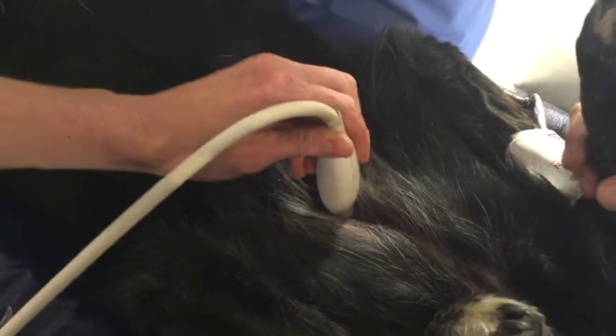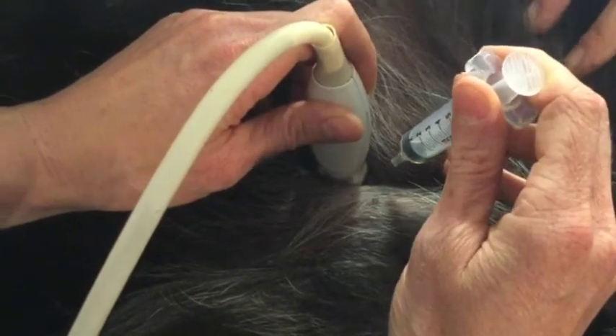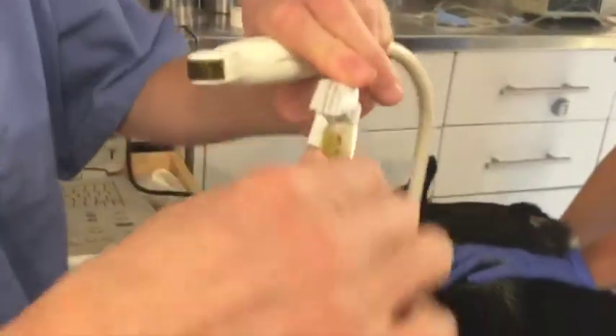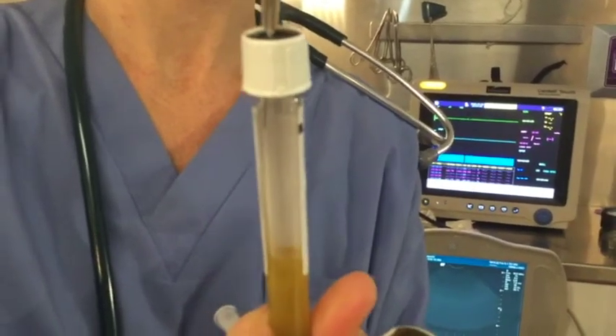For routine diagnostic cystocentesis, an appropriate size needle and syringe is adequate, advanced smoothly and deliberately. It is recommended to switch to a sterile needle before injecting the sample into a urine collection container to minimize the risk of contamination.